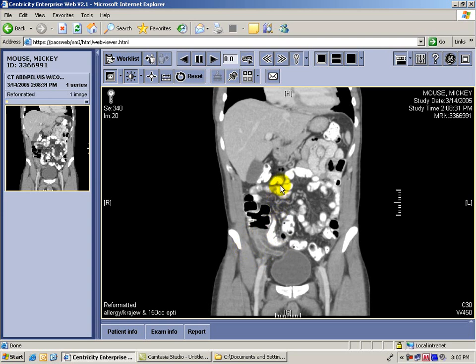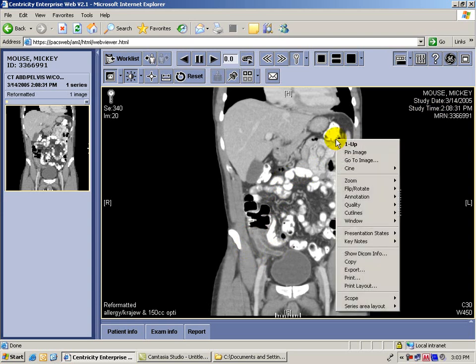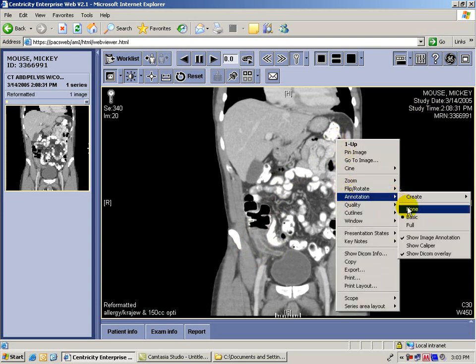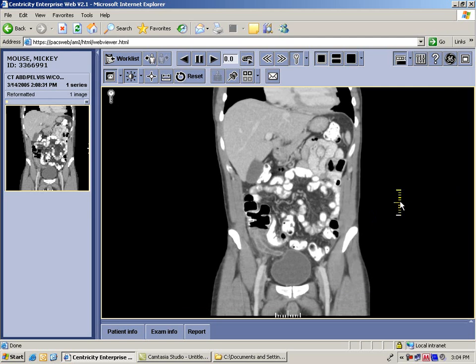So when you go to PACS and want to save this image, you'll notice that there's patient identifying information here — in this case, Mickey Mouse. Sometimes that writing will overlie the image, and what you can do is get rid of the annotation by selecting 'none.' That way, if there's any writing overlying the image, for example the 'H' that used to be up here, it's gone.